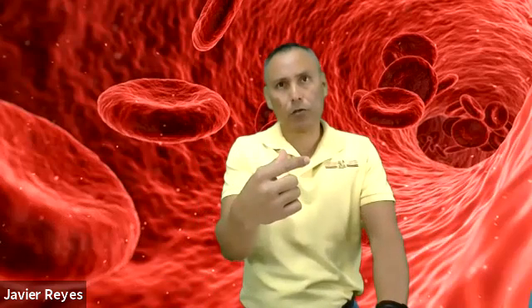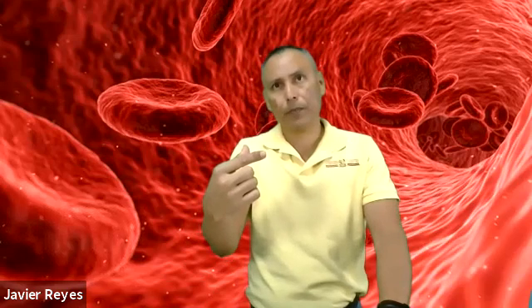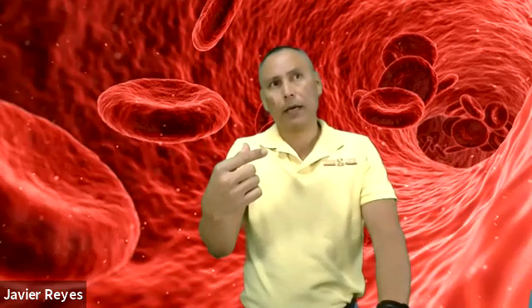If the bevel is completely through the vein, there is no blood flow. You can easily tell when you went through it because there's no blood flow, and you can tell that a lot of the needle has gone into the patient's arm. You're probably too far. So slowly come back, slowly come back, until you see blood return. If you see blood return, try to make the readjustment if possible. And remember, do not do any blind probing or side to side probing.